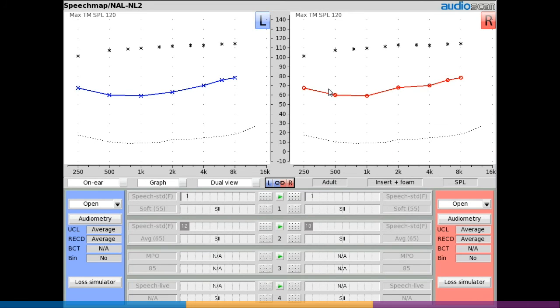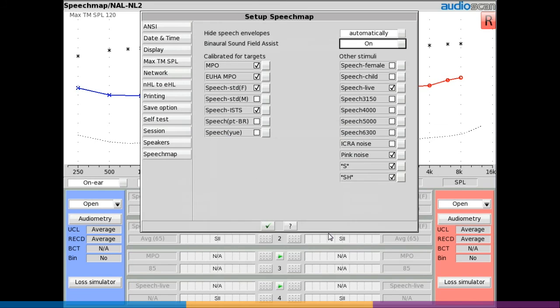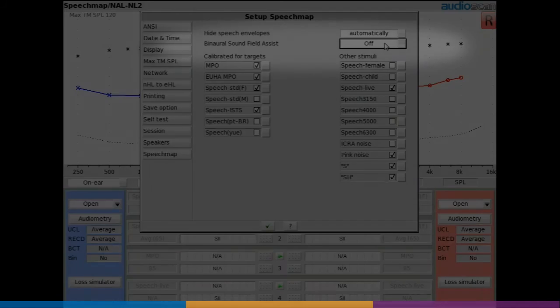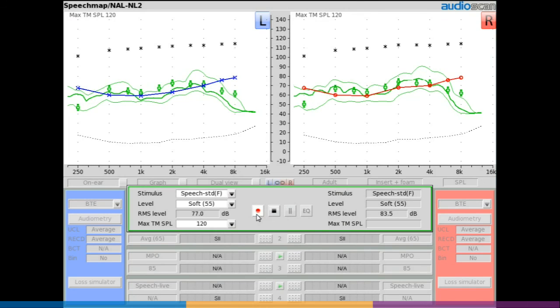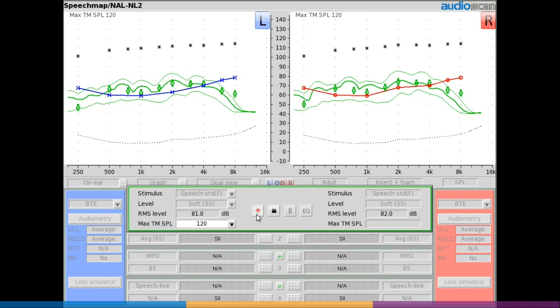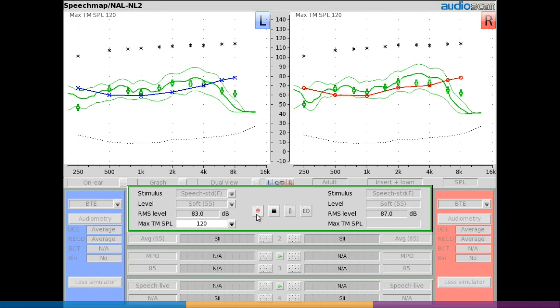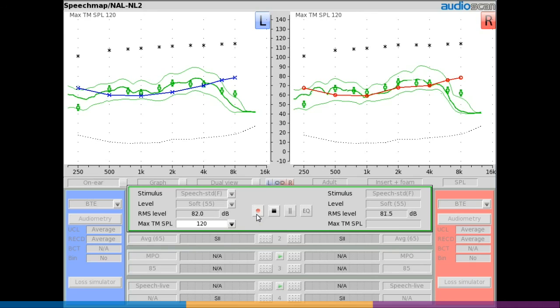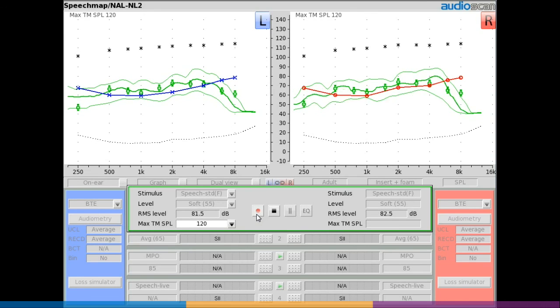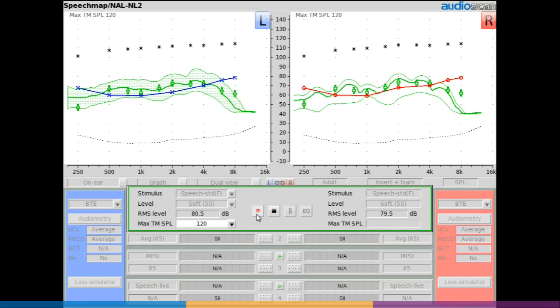If binaural sound field assist is deactivated in the setup menu, simultaneous on-ear measurements are still possible. However, if a mismatch in the stimulus level between the ears is detected when the record button is selected, the ears will be measured one at a time in quick sequence. The difference in sound field at each ear will be accounted for and detectable by the difference in level and spectrum of the stimulus presented during each measurement.